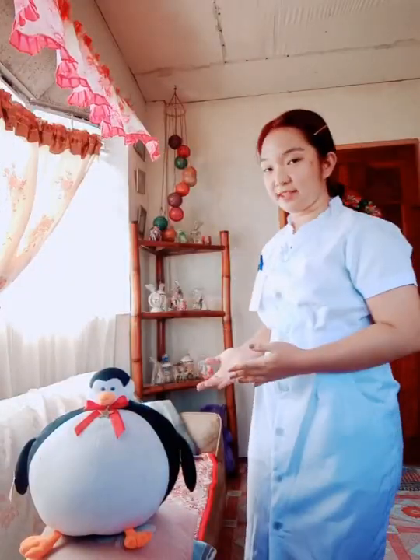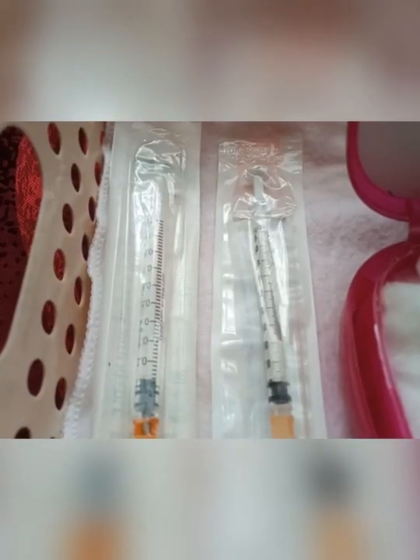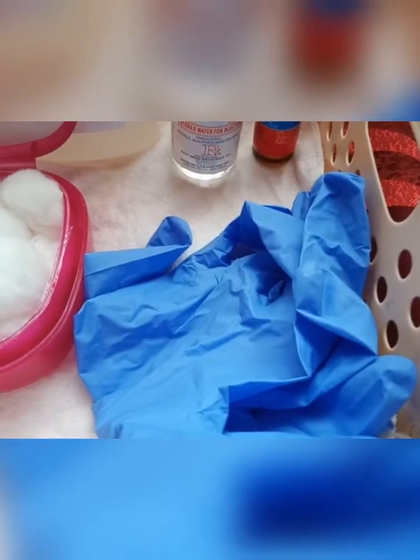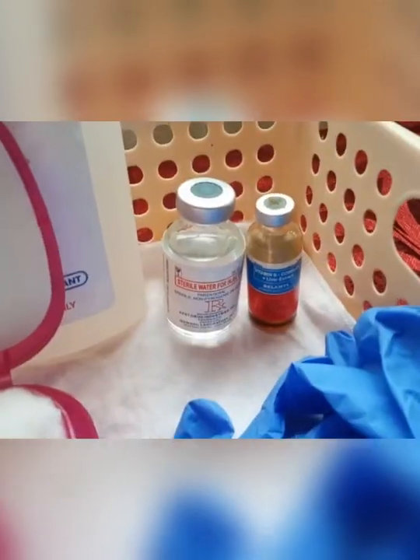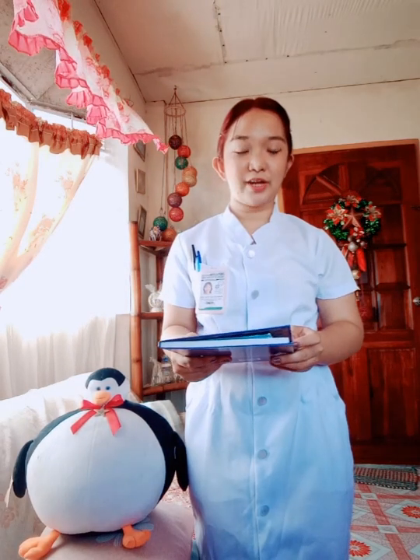The second step in preparation is to determine whether the size of the muscle is appropriate to the amount of the medication to be used on the patient. The third step in preparation is to assemble equipment and supplies: tuberculin syringe, sterile cotton swabs, surgical gloves, the vial or ampule, as well as the alcohol to be used. The fourth step in preparation is to check the MAR or medication administration record.